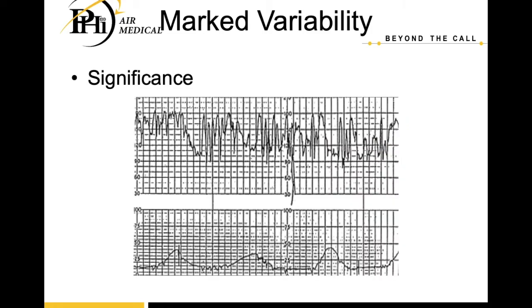As for the significance, in and of itself, marked variability is not a sign of fetal distress. We need to be looking for other non-reassuring signs like decelerations and baseline changes and things like that.